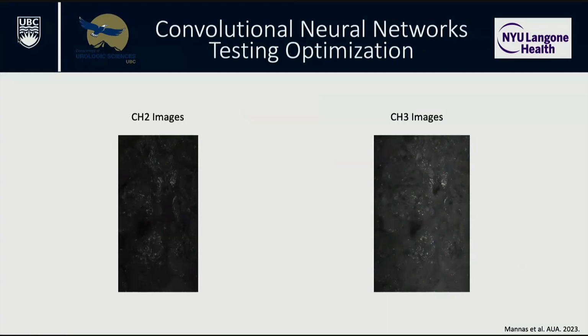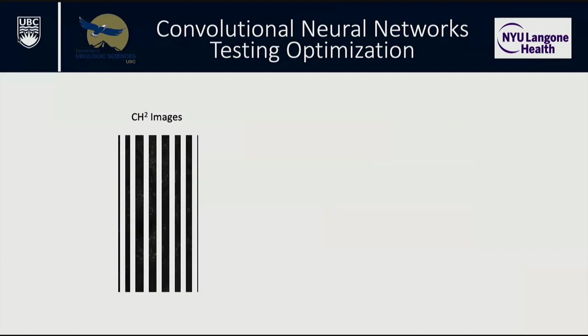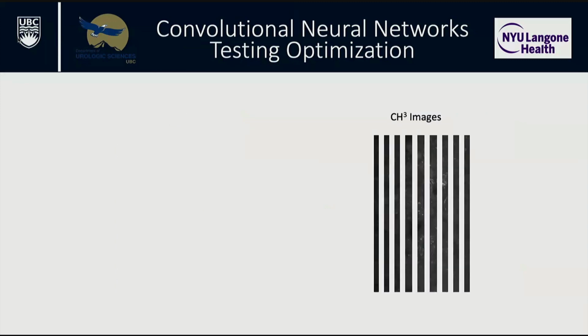To make the SRH, you need the CH2 and CH3 with a color overlay, and that's for the visual eye. But for artificial intelligence, you can use the CH2, you can use the CH3, or you can start skipping lines. You can skip half the lines, then increase the size of the lines that are left to make it look like a similar image. We tested the assessment with that too. Now we're scanning at 2 to 3 scans per biopsy. So it's 8 to 11 minutes for visual assessment in SRH, but it's 2 to 2.75 minutes if AI is doing this.